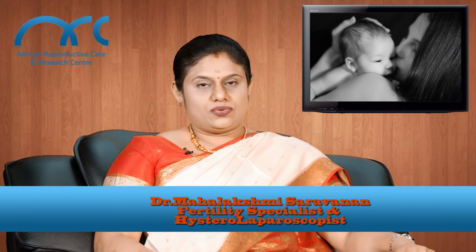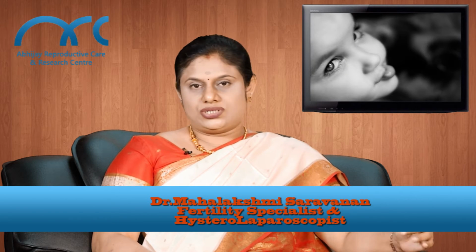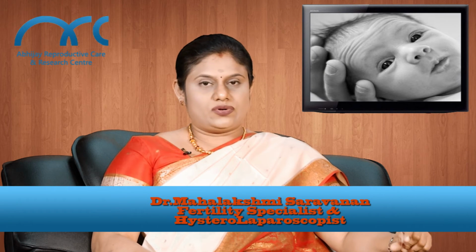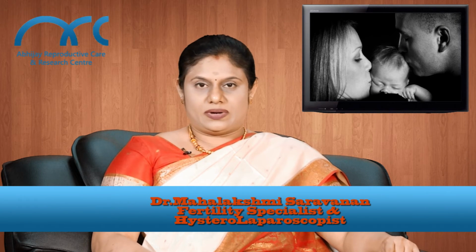I would like to just highlight a few things about the hysteroscopy. Hysteroscopy is a diagnostic as well as a therapeutic tool. So there are a few groups of patients who really benefit a lot by this procedure. It is not a recommended procedure for the whole population as a whole. Usually if we have to do a hysteroscopy, we will have to do it roughly between the 6th to 10th day of the menstrual cycle to be sure that the female partner is not already pregnant.